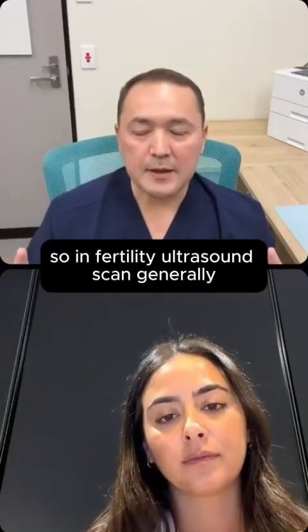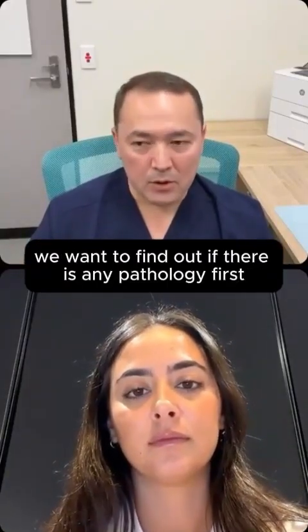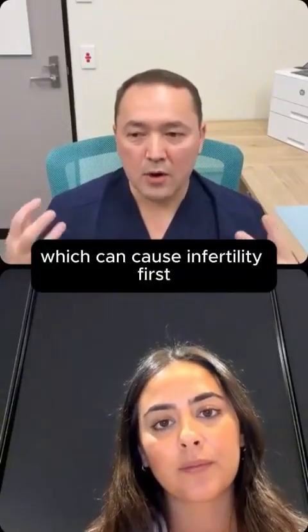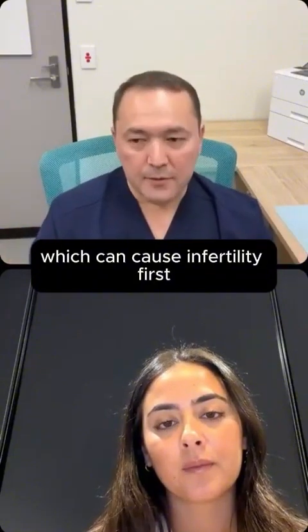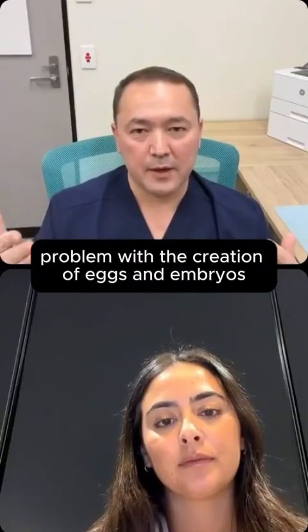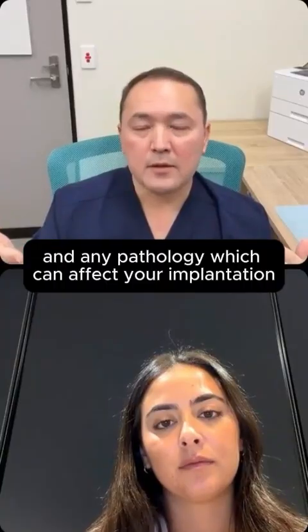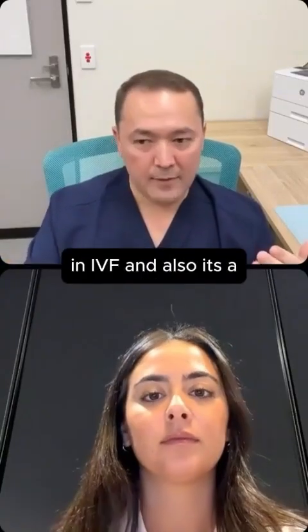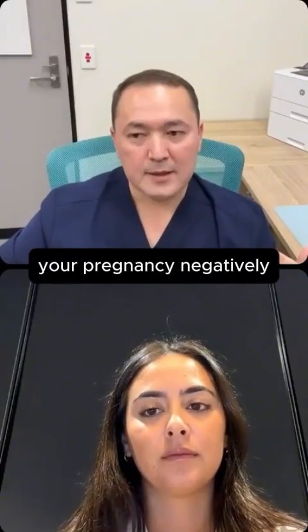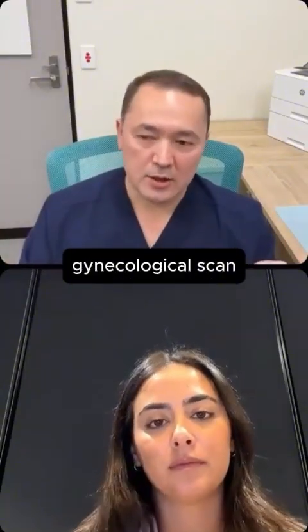In a fertility ultrasound scan, generally we want to find out if there is any pathology. First, any pathology which can cause infertility, any pathology which can cause problems with the creation of eggs and embryos, any pathology which can affect your implantation in IVF, and also any pathology which can impact your pregnancy negatively. So that's a much more systematic scan than a gynecological scan.